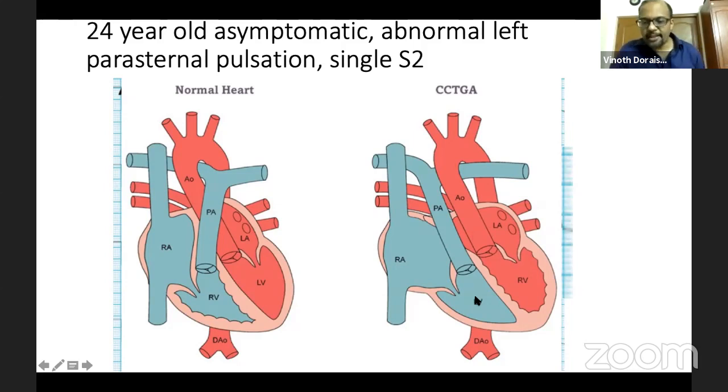So because of that, the left ventricle comes to the right side and the right ventricle comes to the left side. So now the septal depolarization wave will travel from the left ventricle, which is posterior and inferior to the right, to the right ventricle, which is anterosuperior and to the left. So definitely the Q waves will not be in the left-sided lateral leads. Okay, so that's why you have the absent septal Q waves in the left-sided lateral leads.